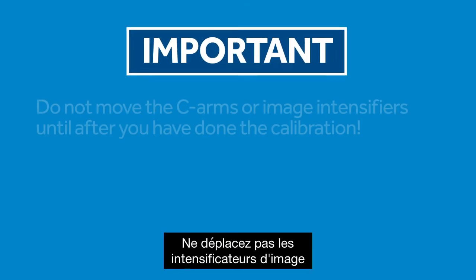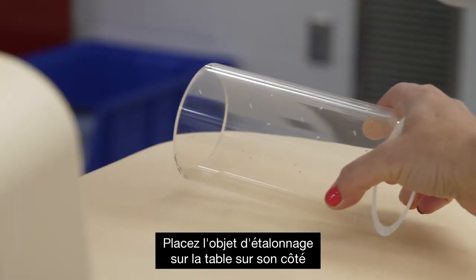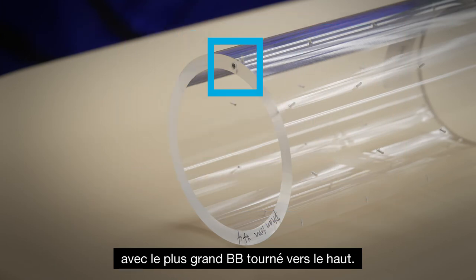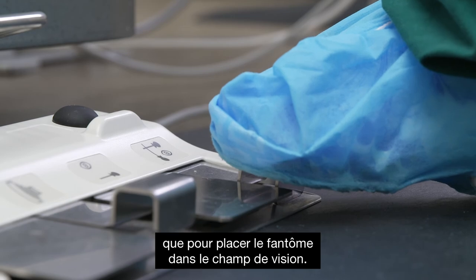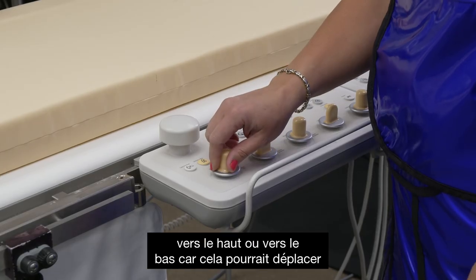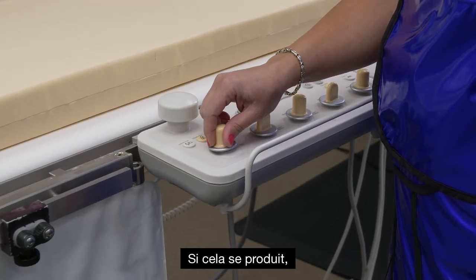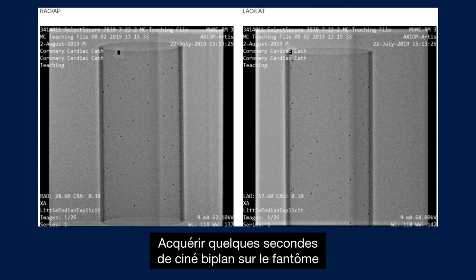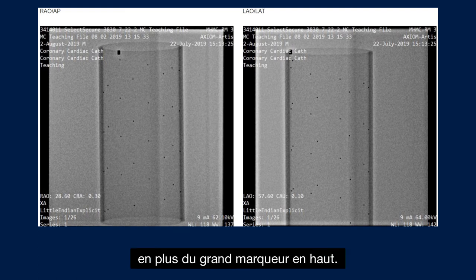Do not move the image intensifiers or the position of the C-arms. Put the calibration object on the table on its side with the larger BB facing upwards. You can translate the table only to get the phantom into the field of view. Limit moving the table up and down, as this may automatically move the image intensifiers. If this happens, the image data is not usable. Acquire a few seconds of biplane cine on the phantom to include at least 13 BBs in both planes in addition to the large marker at the top.